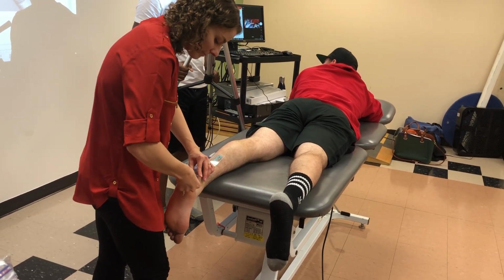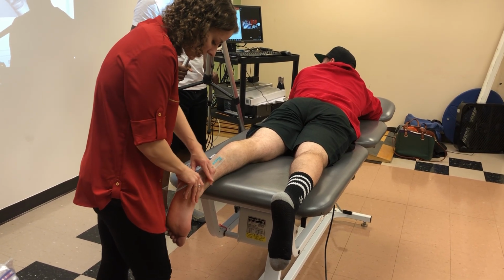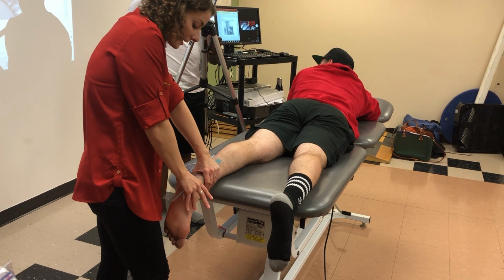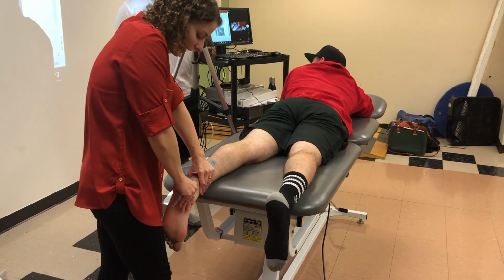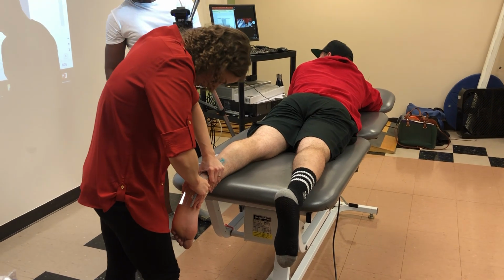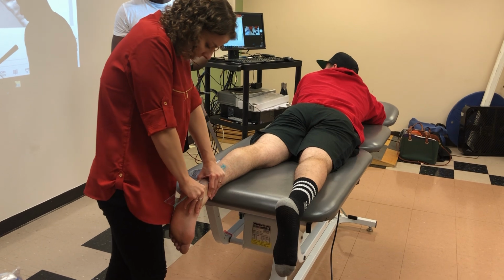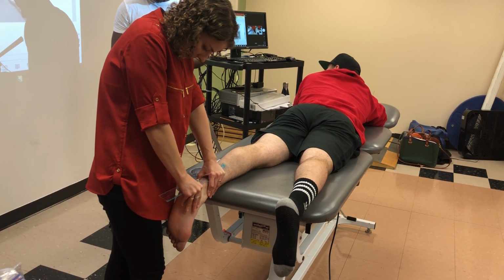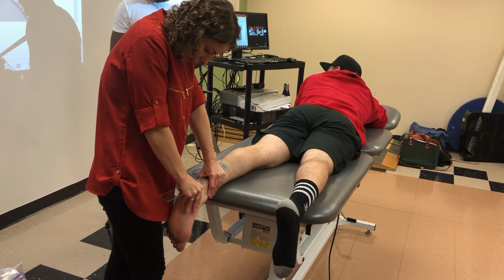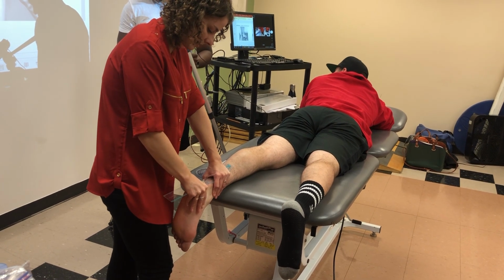And then the midline of the calcaneus is where your distal arm is going to be aligned. And then from there, you can cup around the goniometer and go into inversion. Okay, so I get about 20 degrees. And then eversion, again, typically there's less rear foot eversion range. And he has about 6 degrees there.